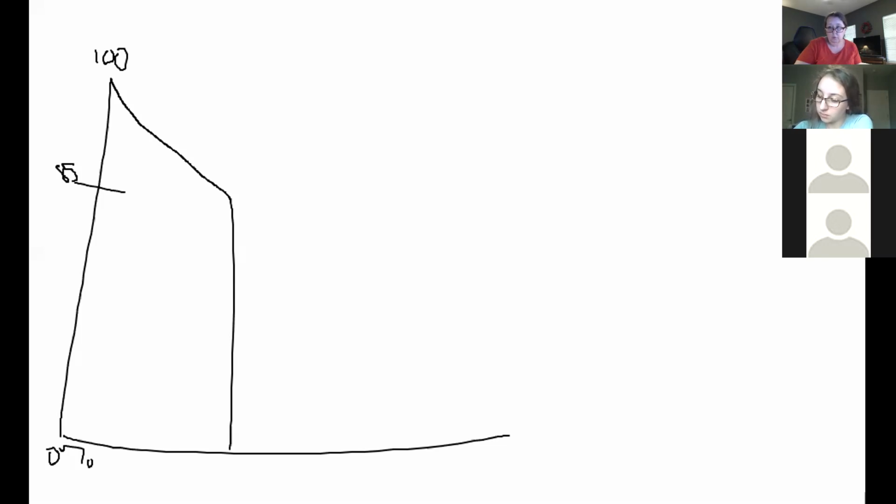Now, normally you don't want it to be on pigmented tissue. If you have a black chow, well, it could be a tan chow. Most chow chows have black gums, even a black tongue, which will impede light flow. So you have to try and find an area on them that is not pigmented. That could be the toe web, the prepuce, the tongue, the pinna, sometimes the vulva fold, the Achilles tendon. If you've ever seen a greyhound or a whippet that's super thin, right over the hock, I've sometimes put it over that tendon because it's really thin skin.